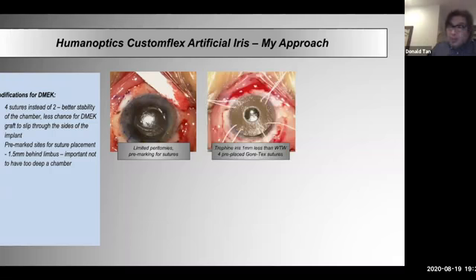They always recommend refining this, because 12.8 is pretty large, and you usually measure the standard white to white diameter on the table. And if you're suturing this, it's 1 millimeter less. So if the white to white is 12, my usual size is maybe 11 millimeters. I'll just use a standard PK trephine. And you can see here, I've already trephined it, and I've used Gore-Tex sutures, and these are mattress sutures that we've used to secure the implant.